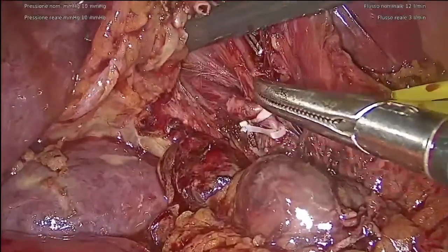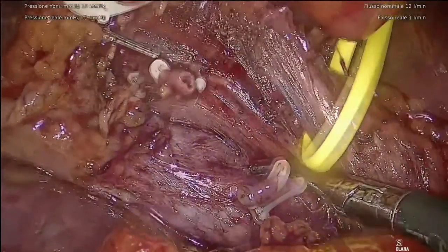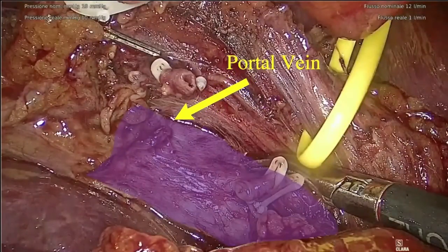Finally, we identify and isolate the right portal vein.